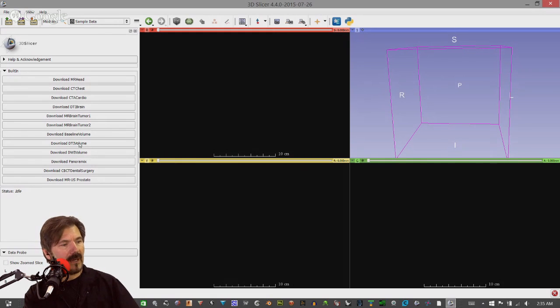Okay. So there are obviously a number of different types. Ultrasounds also have a DICOM variant, and that's becoming popular because the type of radiation is ultrasonic, so it appears to be safer. We'll see what the long-term efficacy or study is on that. But that's popular, and it's actually less expensive as well. And we're starting to see that, especially in the fetus market, people wanting to see their baby.